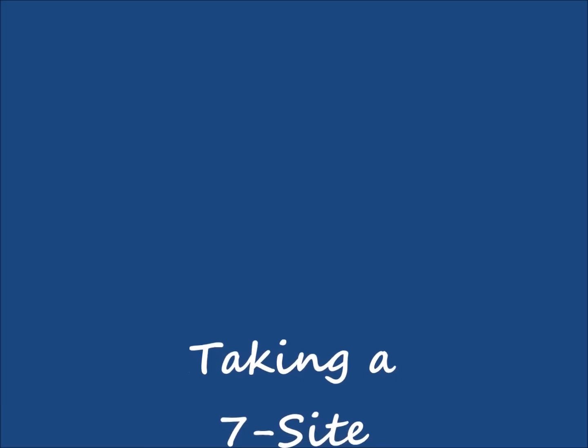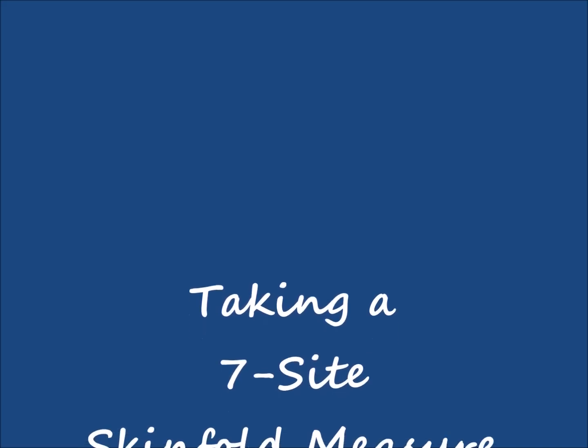Today we're going to be showing you how to take a seven-site skinfold test.